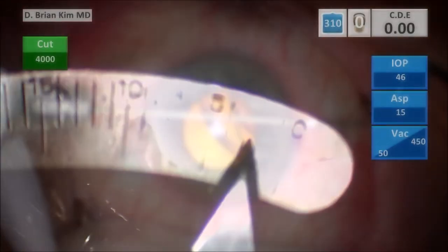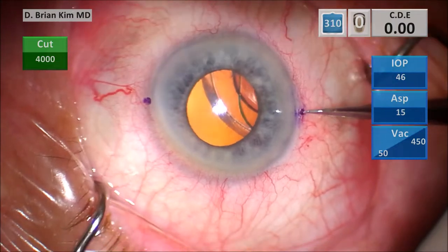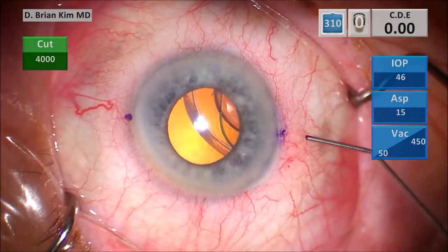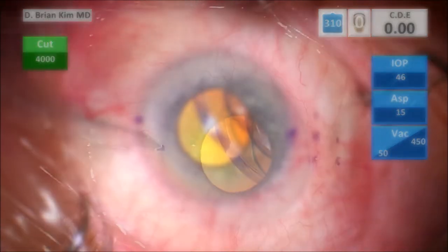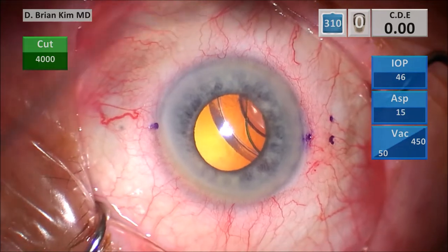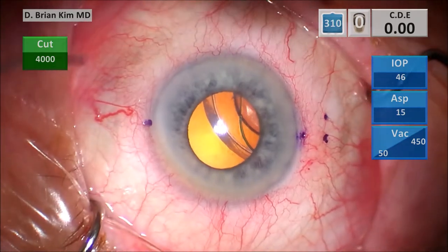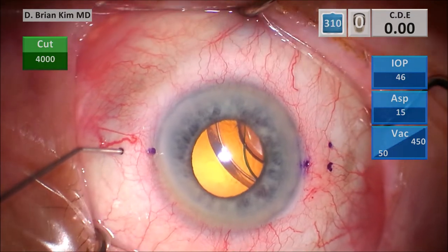This caliper is set at 2.5 millimeters, and I make a mark 2.5 millimeters posterior to the limbus in radial fashion, then using the cannula that's pre-marked to mark 2 millimeters adjacent. I do the same thing on the left side, again indenting the sclera 2.5 millimeters posterior to that first mark with the caliper, and then using the marked cannula tip to mark that spot as well as 2 millimeters adjacent.